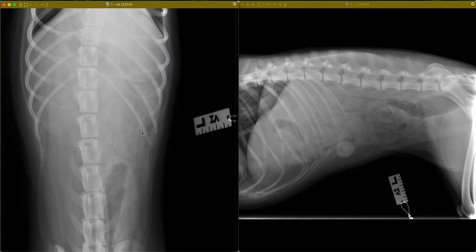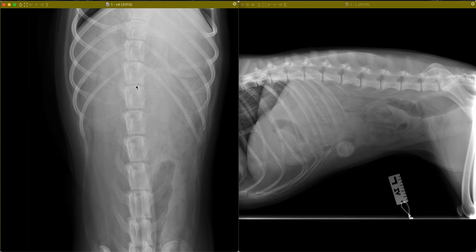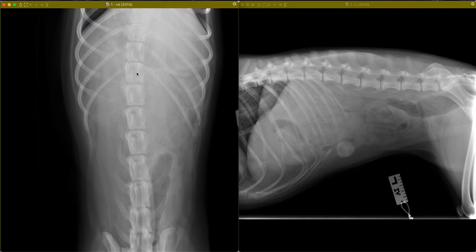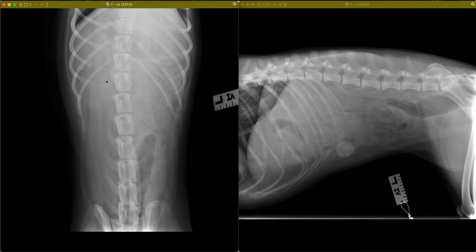On the ventrodorsal view, we don't see this structure particularly well until we start to inspect the region adjacent to the vertebral column at the level of T13-L1. In this area, we see it correspond to the region where we would anticipate the transverse colon. However, on the lateral views, this structure is fairly ventral to where we would anticipate the transverse colon. So if we construct the abdomen in our mind's eye, this would still place this structure in the region of small intestine.